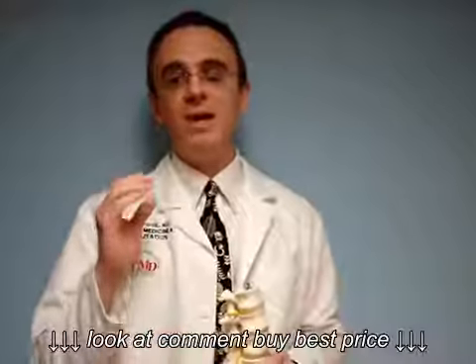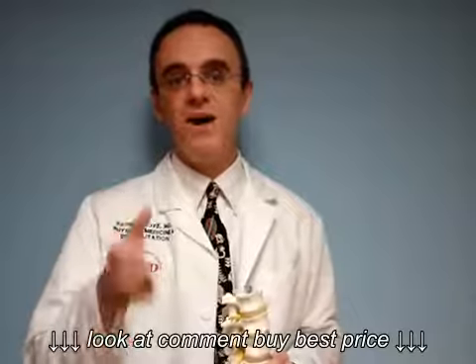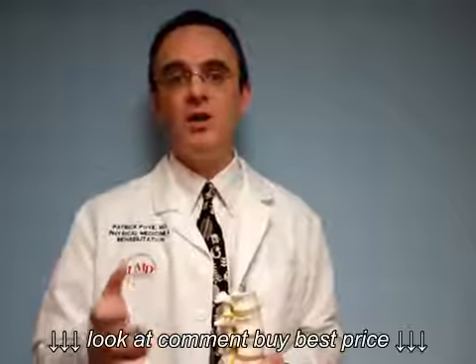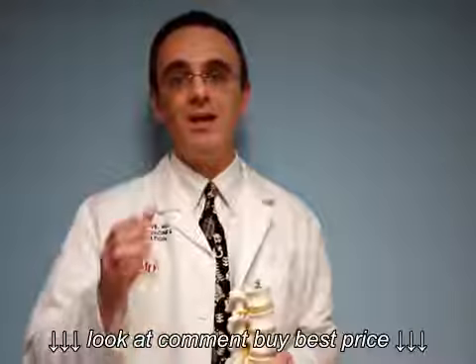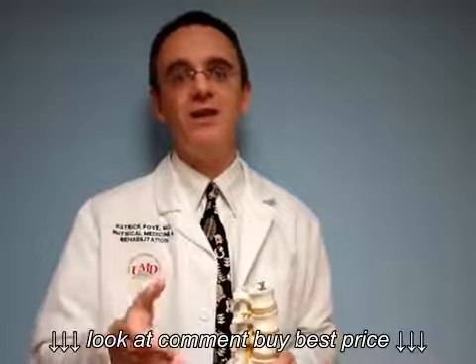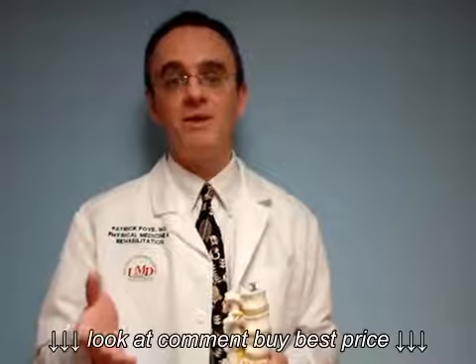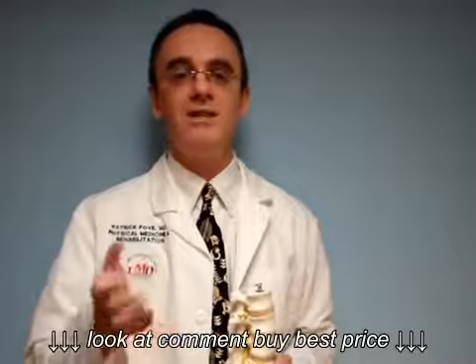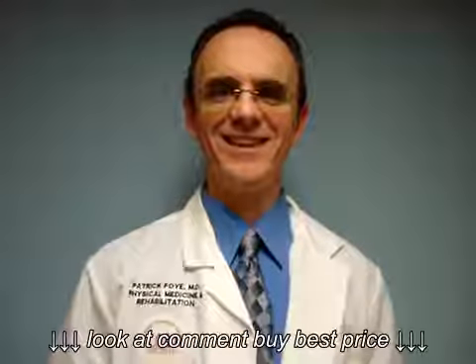So really, it's important to take responsibility for this. Find out as much as you can. Read the orders, read the report, look at the images, and that will help you to know if you're suffering with tailbone pain and you're having x-rays done or had x-rays done, did they actually include the coccyx or tailbone in the first place? I also have images online that you can use to compare your x-rays with, posted on the website, tailbonedoctor.com.